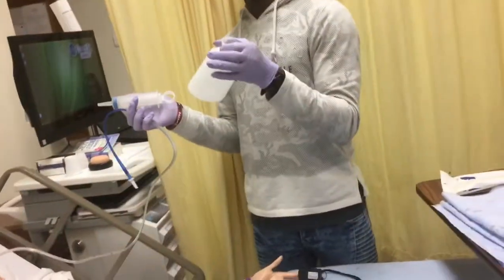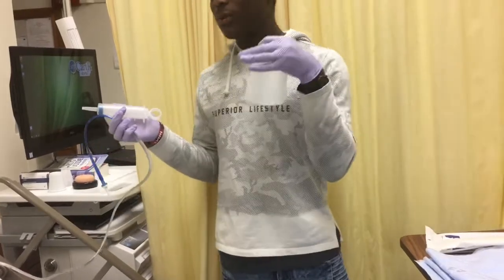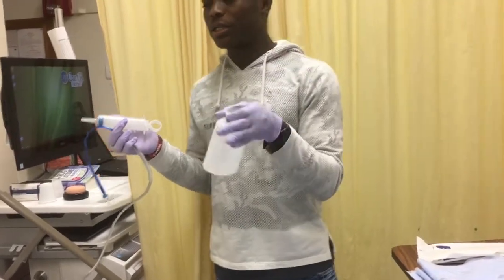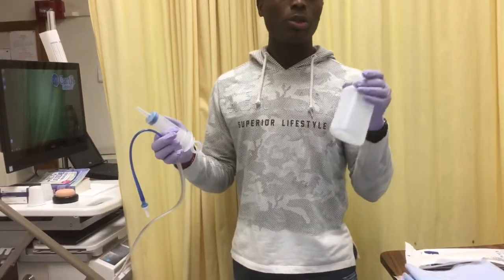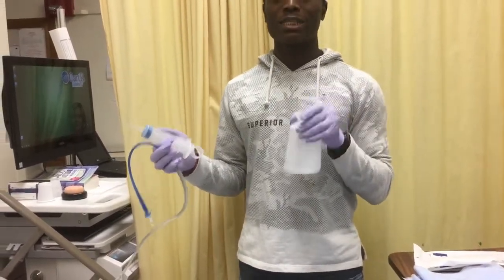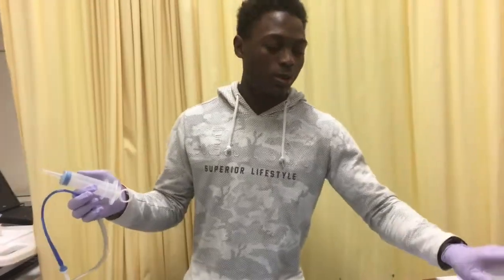But in the case that the patient has the same 300 milliliters or like 280 milliliters, it means there is a lack of peristalsis or something like that. It means the patient is not digesting the food properly. So you do not want to give them that food if they're not digesting the food properly. But if they are digesting the food, then you want to give them the food the doctor ordered.